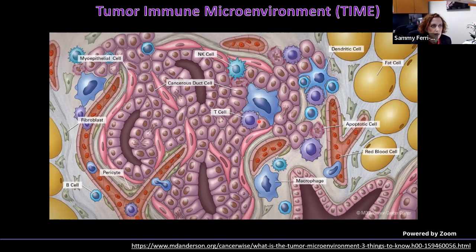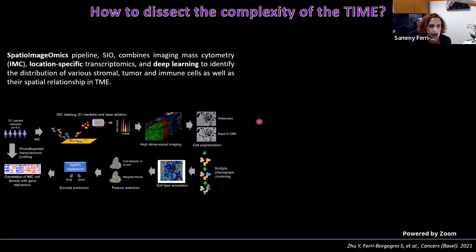In the last few years, we've been utilizing multiple approaches to characterize as deeply as possible the ovarian cancer tumor microenvironment. I would like to show you a couple of approaches that we utilized, highlighting the shortcomings of these approaches and what we came up with during the last year to fill in the gaps.